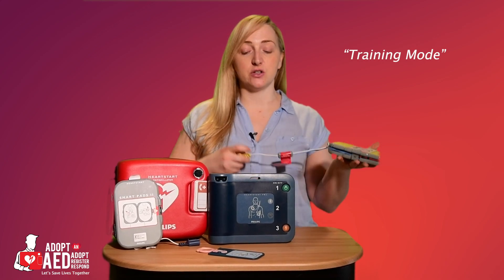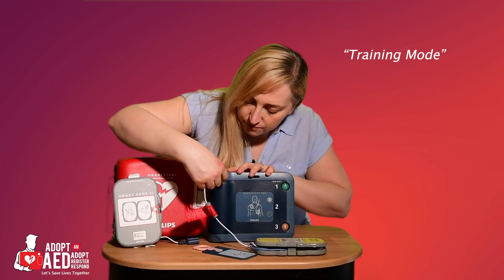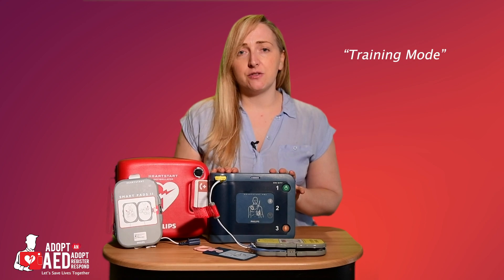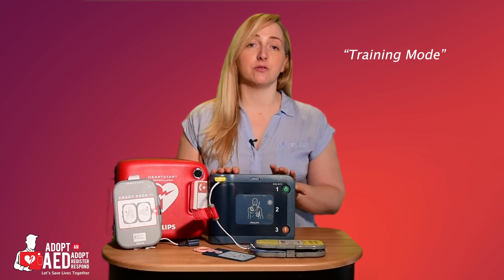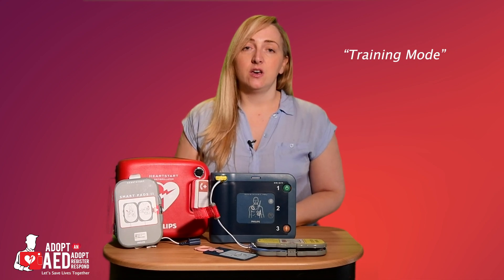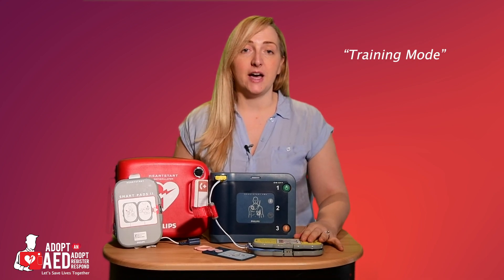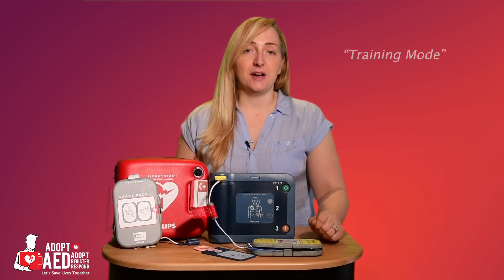There are also training cartridges that can be plugged into the FRX AED to temporarily turn your defibrillator into a training unit. This is excellent for encouraging regular refreshing of skills, and for first-aid businesses, it cuts back on business costs. Once in training mode, the user can use any of the 8 real-world training scripts that are pre-programmed into the pads. This can be used with a training mat or adapters to a mannequin.